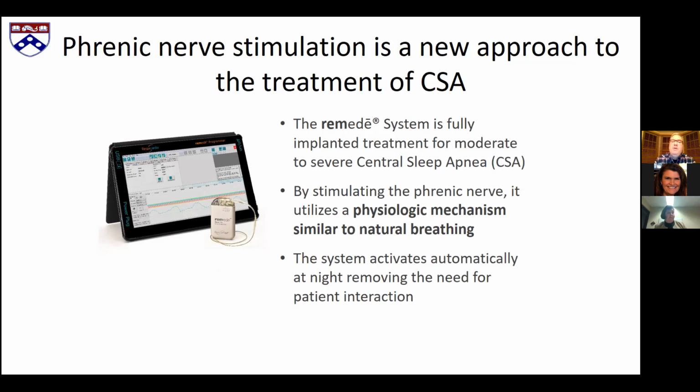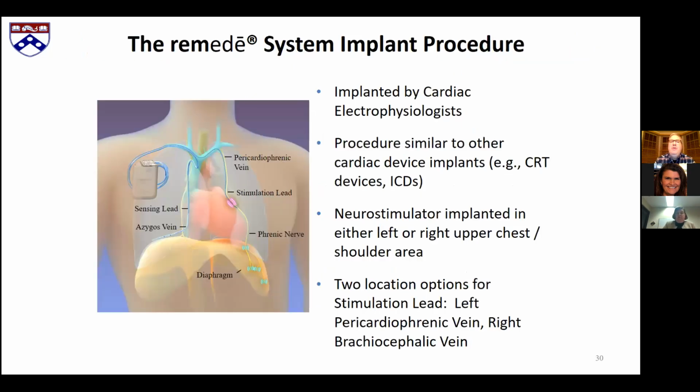We can program the device like a pacemaker to come on at a certain time and know when the patient is lying down. And so it's really a passive therapy once it's in. And so they can be treated nightly without a lot of effort on their part.